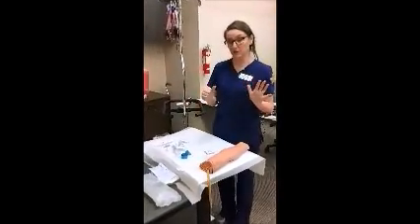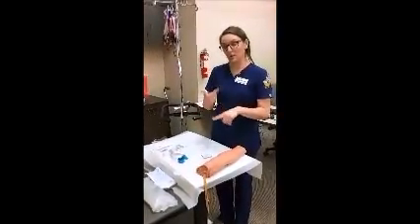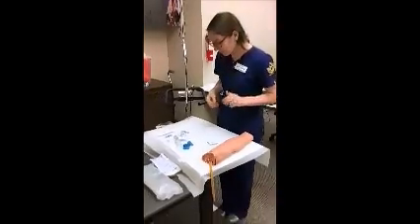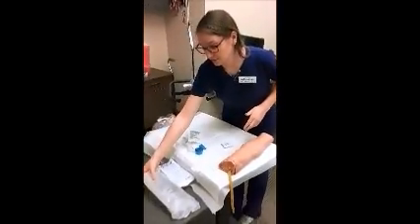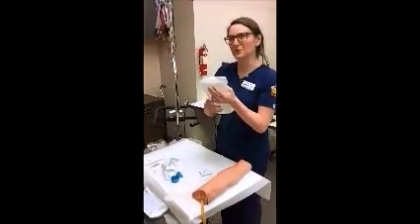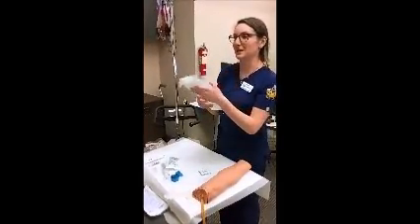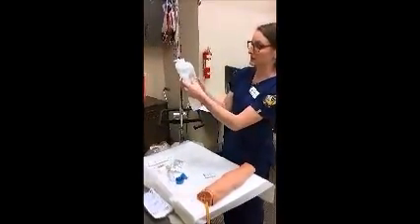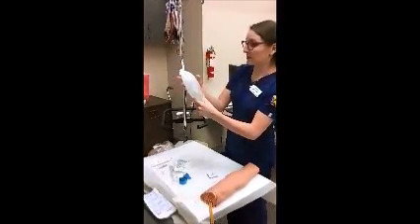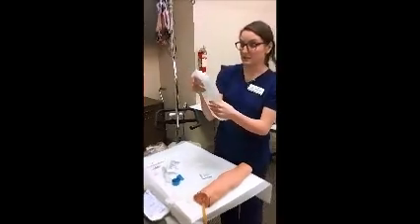So that would be our 6 rights of medication: right dose, right patient, right time, right route, right documentation, and right medication. So in preparing our solution, we will pull this from the Pyxis, verifying our 6 rights of medication with the MAR, and we can see that this is 0.9 sodium chloride injection, 1,000 milliliters. The expiration on it is March of 18.